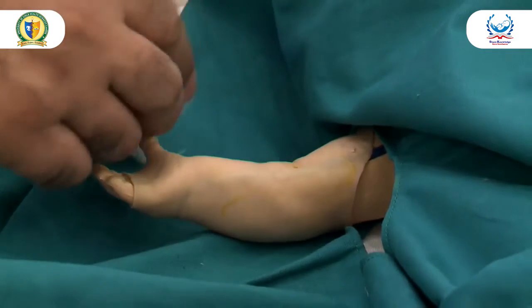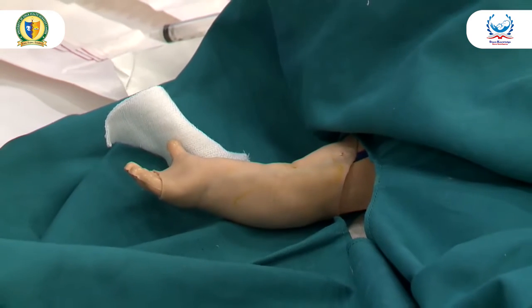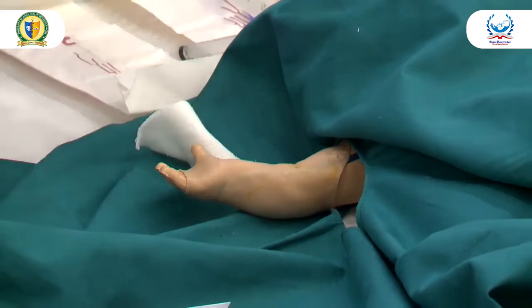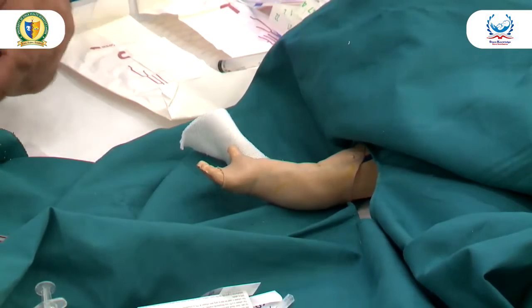When the bleeding stops, you can even put a single plaster. What's that called, the one we put on a wound? Saniplast. That's all. Nothing else, just leave it.